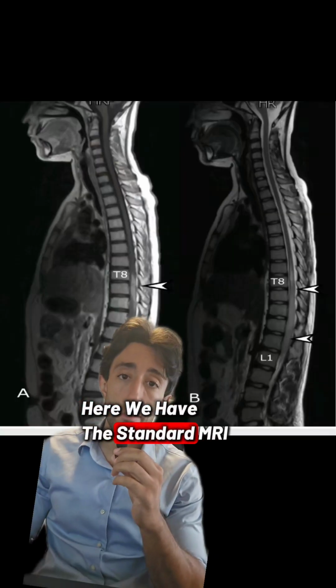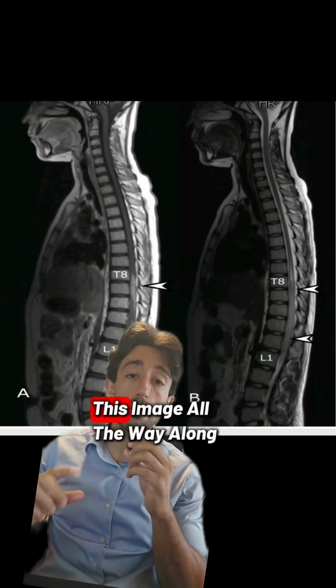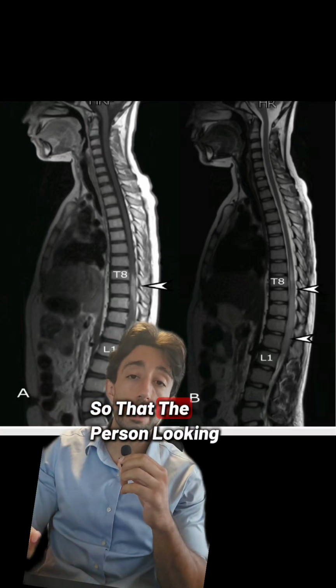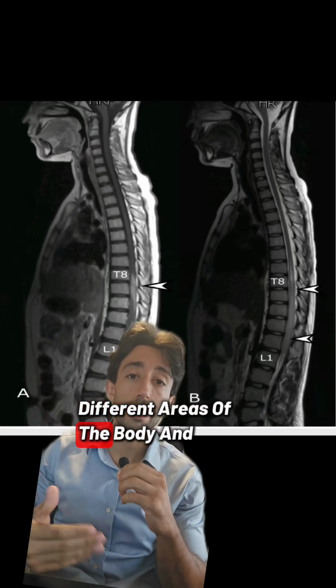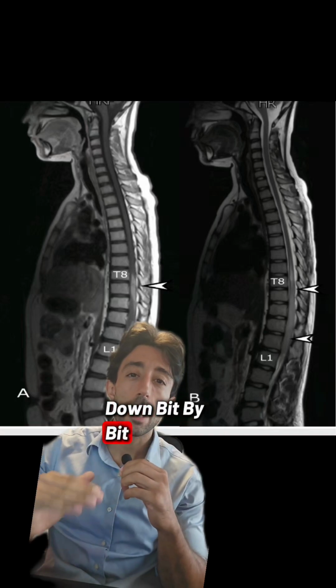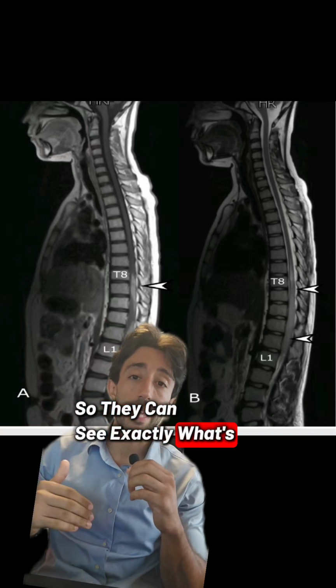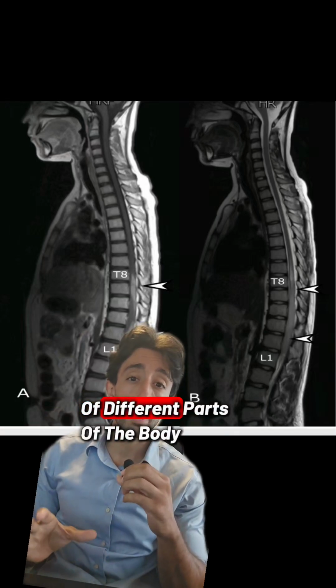Here we have the standard MRI. This is where it's going to be taking this image all the way along the body, and then it's going to be cut into slices so the person who's looking at it can see different areas of the body, and they can kind of break things down bit by bit. If you think of it a bit like an onion, they're going to go through layer by layer so they can see exactly what's at that layer. And this can be applied to lots of different parts of the body.